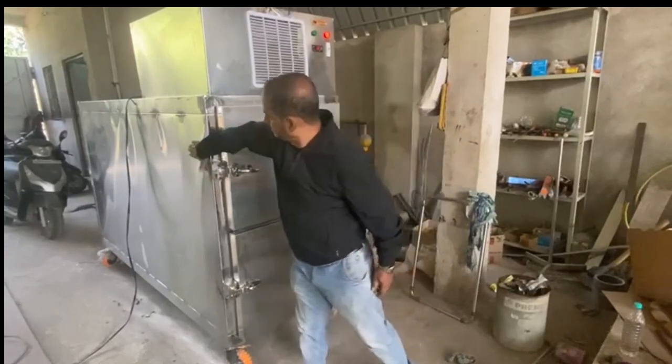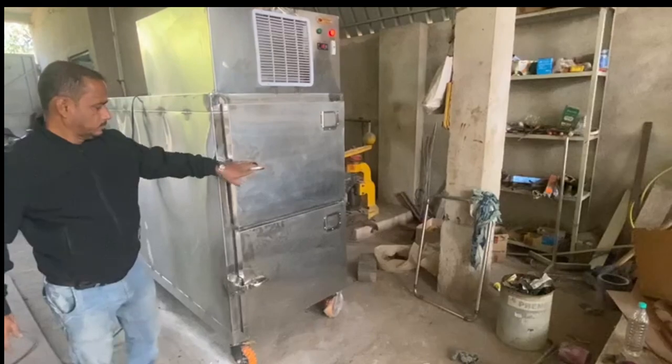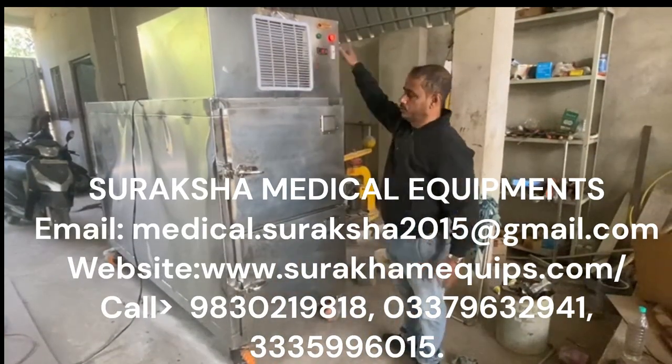The temperature of the freezer usually remains minus 2 to minus 10 degrees Celsius. But this freezer can go down up to minus 20 degrees Celsius.